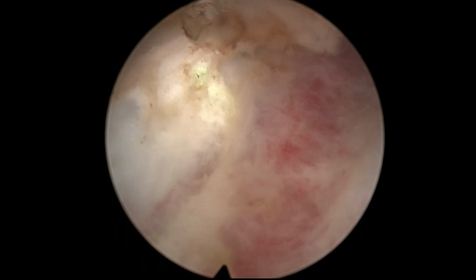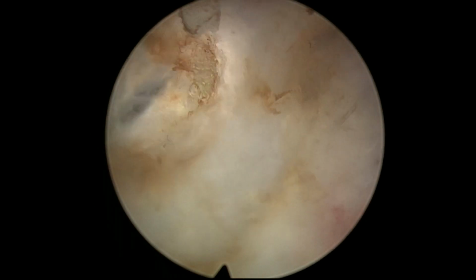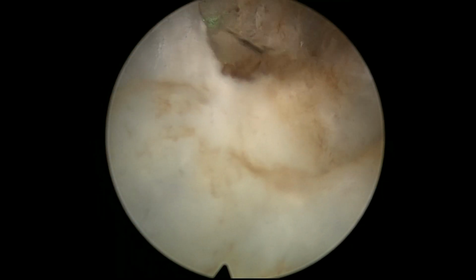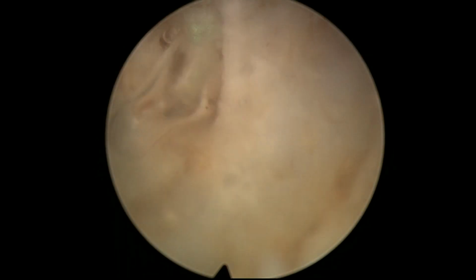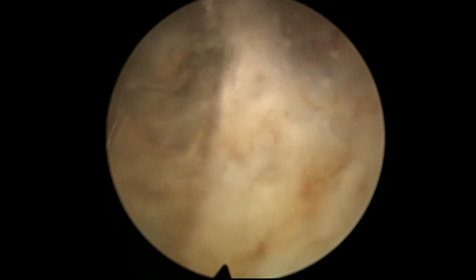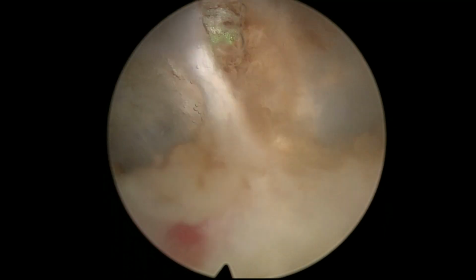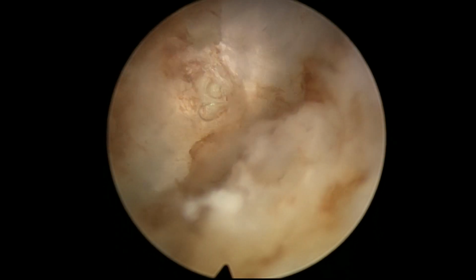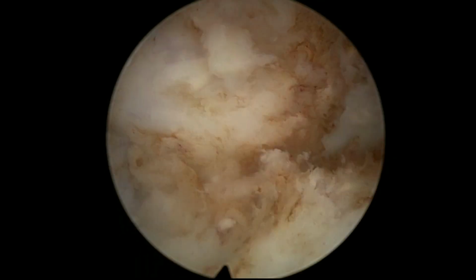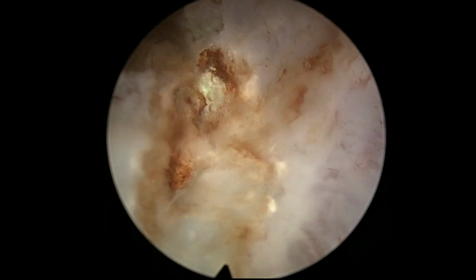One possibility with this laser that cuts so well, there might be a little bit more difficulty finding the right plane for people who are beginning with holmium. On the other hand, the excellent hemostasis helps beginners in the sense that the visibility throughout the procedure is quite good, so you can decide where to go, where to correct, where to cut. So it's quite exciting. I was very impressed with this laser. The quality of hemostasis is amazing. We feel that sometimes it's a little drawback to not be able to have this dissecting effect, but it was interesting.